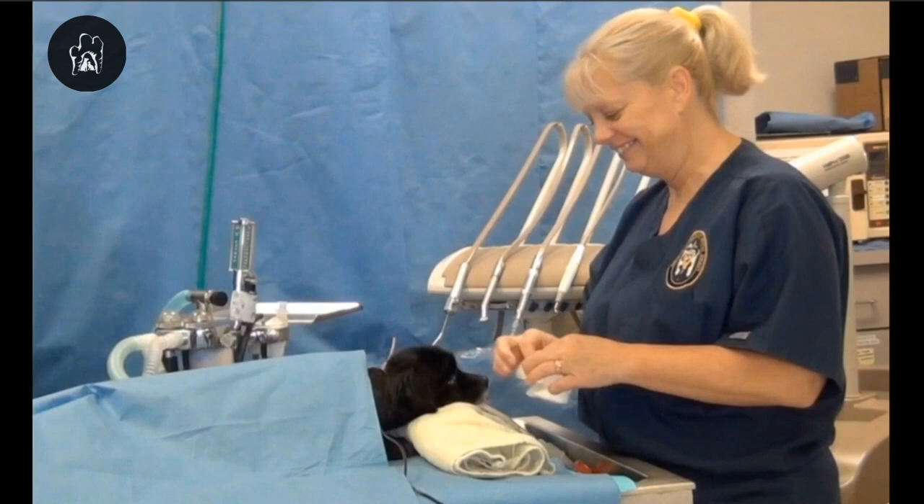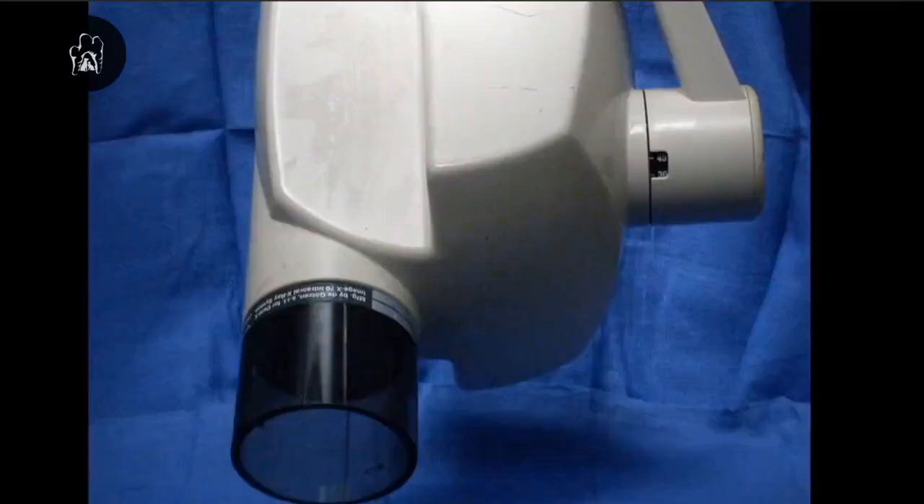We've got a parallel patient that we can now utilize what is on all radiograph units, whether they're human or veterinary — that little number designation on the right side on the tube head that tells you what angle the tube head is set at. So if you're not aware of that on your machine, look at it when you go back into your office and start to use that to determine how to take radiographs. You don't have to do that bisecting angle technique where you try to figure out the tooth position, tube head position, and where the film or sensor is.